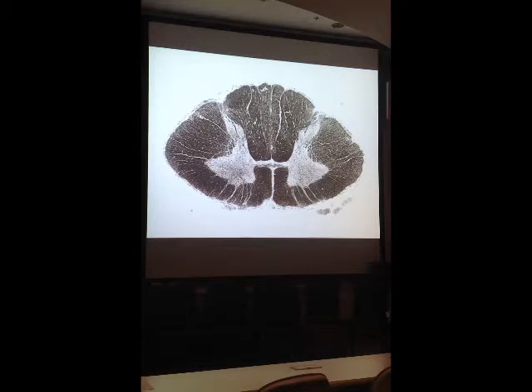Again, my eye usually wants to orient to ventral and dorsal, and the ventral median fissure is one way to do that. Another way is the ventral horns are usually bigger, fatter, wider from medial to lateral. The dorsal horns are usually a little bit thinner, not as wide. So there's several things that help orient you to anterior versus posterior. So here's ventral horn, okay? You really can't make out distinctively the different nuclei that make up the ventral horn. You can see the gray commissure here with the central canal, okay?